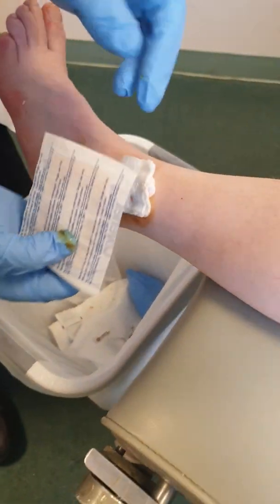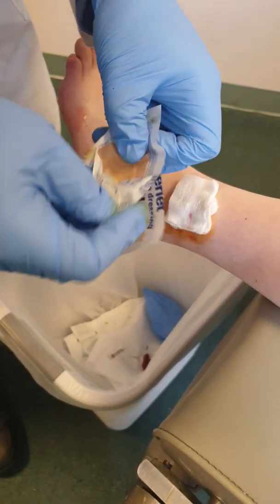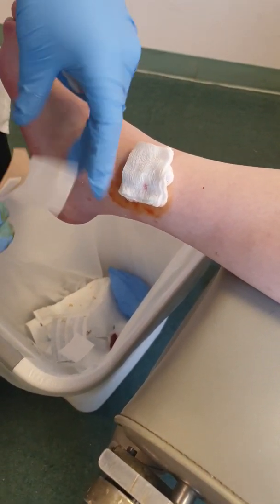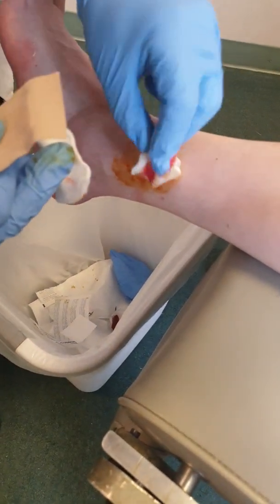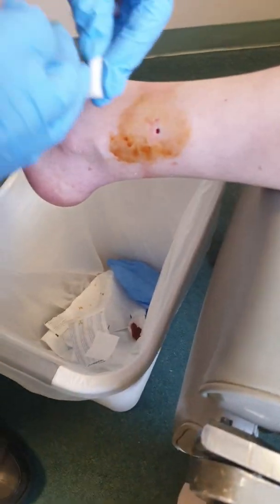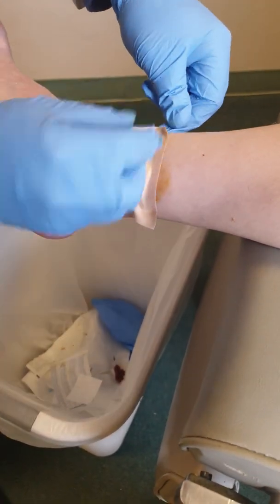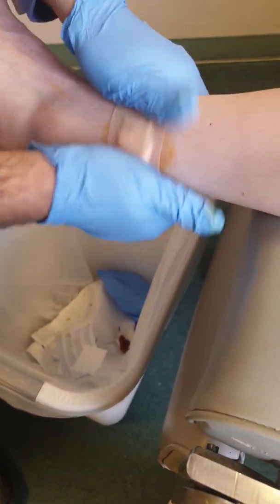It usually comes with a band-aid. I usually double up on that just because sometimes patients bleed a little bit. You don't want to have the glove with the patient. And that's it — we're done on that one.